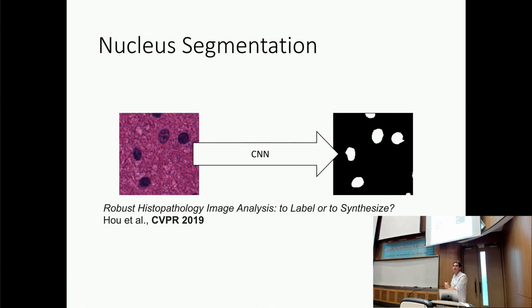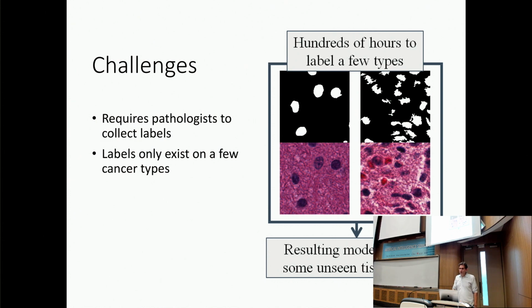Okay? So there is another very popular technique in deep learning, which says that if you don't have enough real data, you synthesize it. You use computers to generate it, which works really well, say, if you want a computer to learn how to drive a car, because you create data on a driving simulation game. You run it for many, many hours, and you have lots of images, and then you can use those images. But there's no computer that knows how to synthesize biopsies, so we were the first to attempt this. This is a technique called data augmentation, a very important technique in deep learning for solving problems.